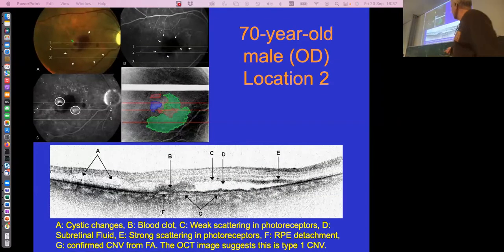Okay, so we go to section number 2, right here. So again, an area where the fluorescein was leaking. And this shows better what is the problem. Because here, what we see now is that here we have this RPE, this scattering layer. Underneath it, Bruch's membrane, they're very close together. But here, what we see is this layer splits up. So here we have the RPE layer, retinal pigment epithelium layer. This is Bruch's membrane, and right in between Bruch's membrane and this RPE layer is a membrane. And this is the neovascularization that grows in response to this overexpression of vascular endothelial growth factor.